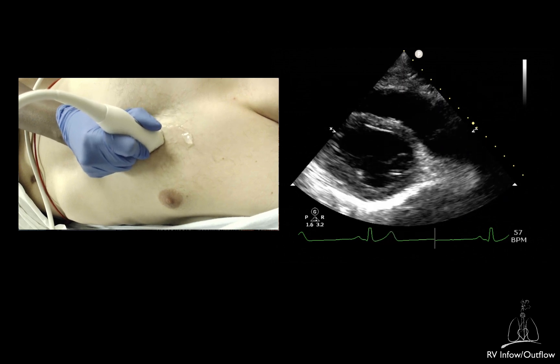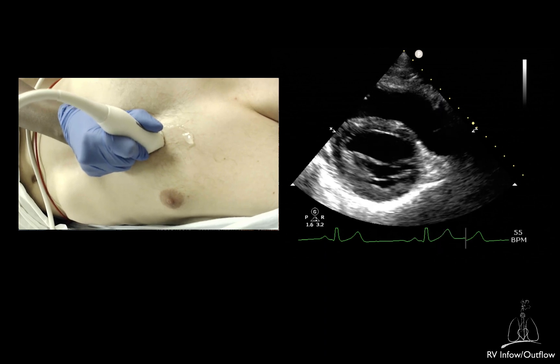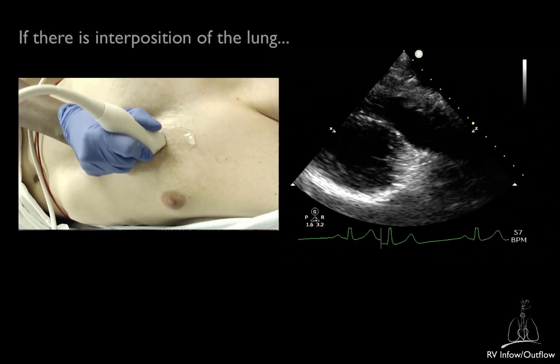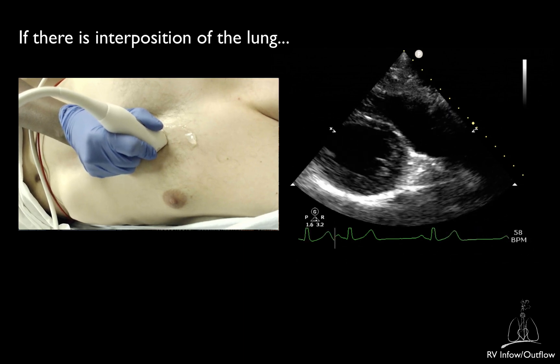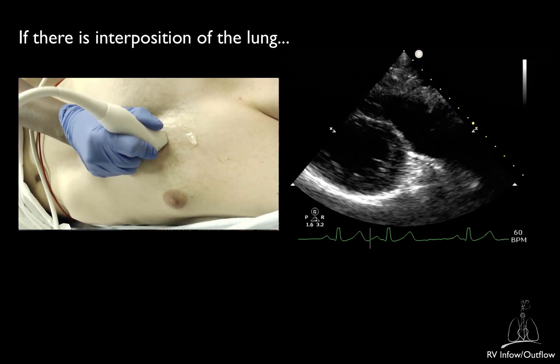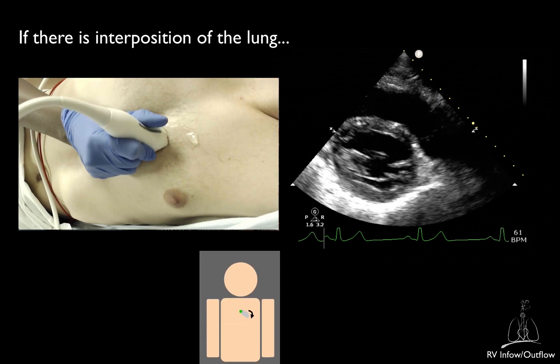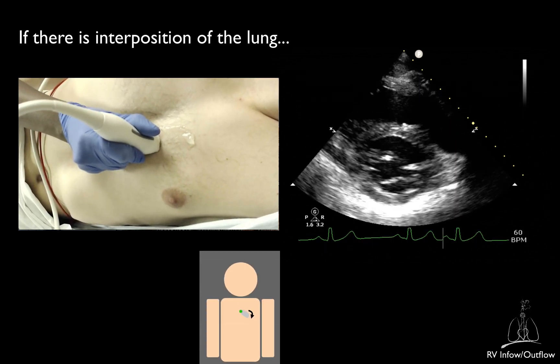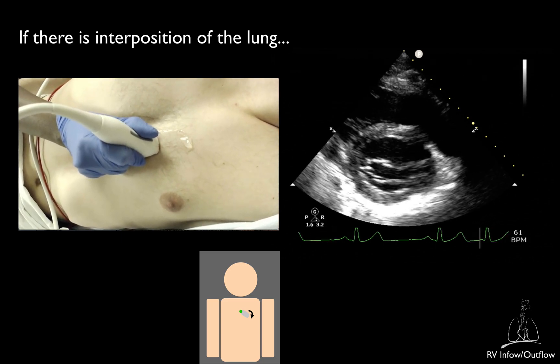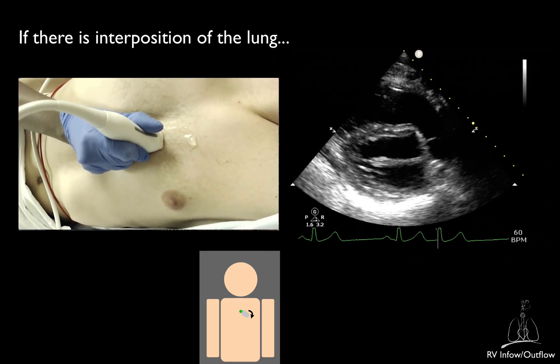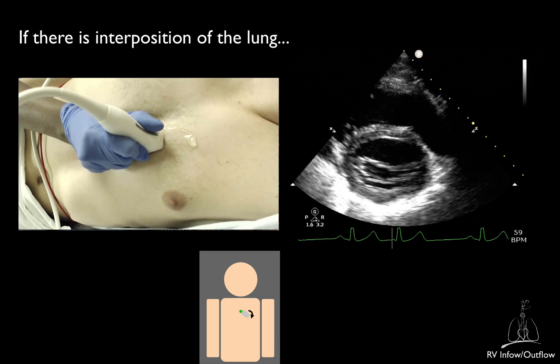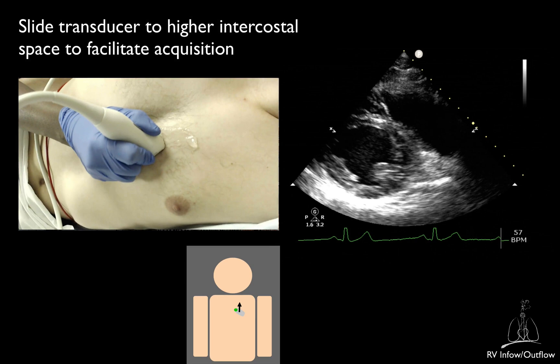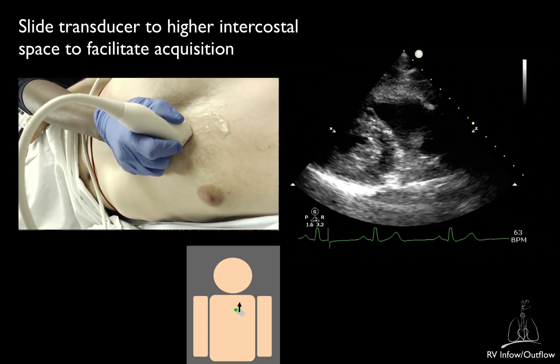In some cases, directing the ultrasound beam upwards will not allow you to visualize the right ventricular outflow tract due to the interposition of the left lung. In those cases, rotating the transducer 30 to 45 degrees clockwise from the parasternal long axis view without changing the beam tilting may allow you to visualize the tract. Sliding the transducer to a higher intercostal space may also facilitate image acquisition.